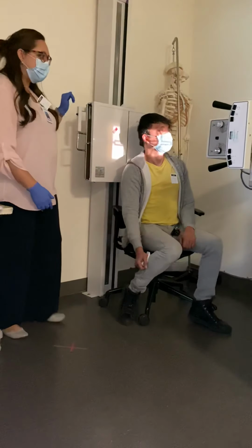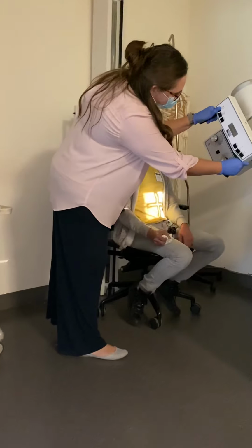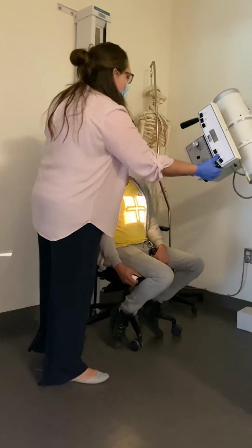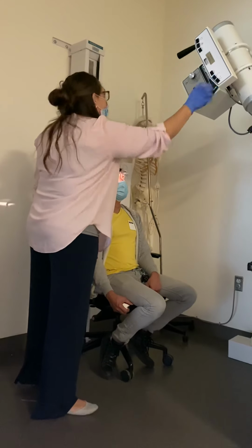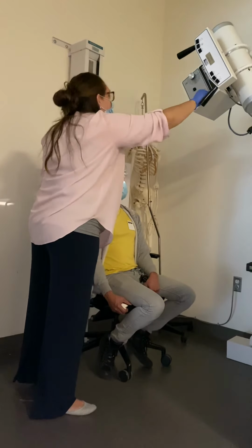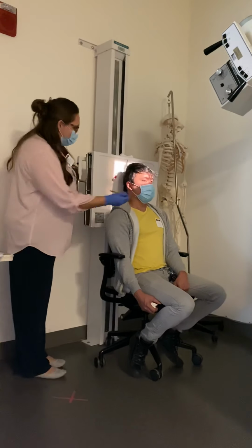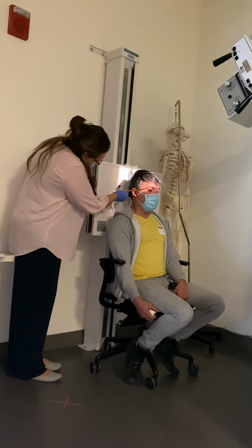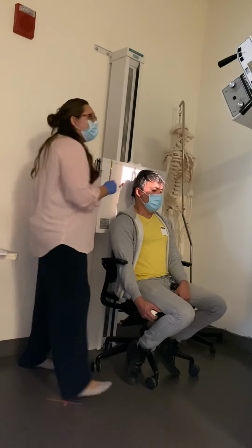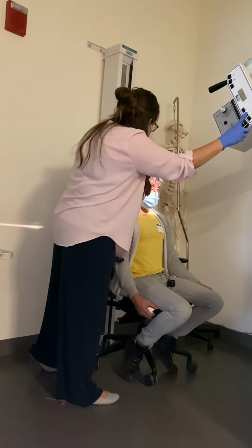So the AP Towne's for the mandible. We're going to go to either a 30 or 35-degree angle. Technically, the book will say 35 to 42. You do not need to go to a 42. And then what we're going to do is have our patient tilt their chin down again until their OML is perpendicular to the IR. Tuck your chin. Oops, I'm sorry, a little bit more. Okay. And then for the mandible, we're going to put our central ray at the glabella.